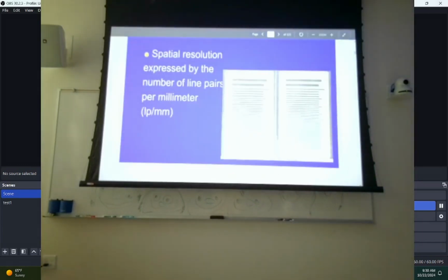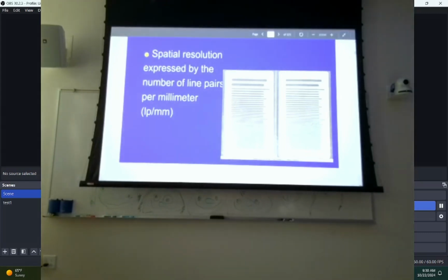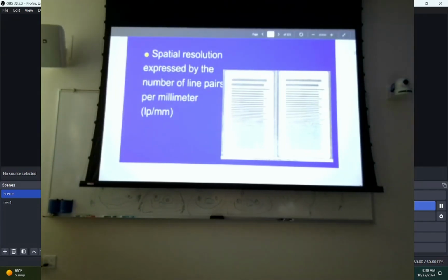This tests two things, essentially. One is your X-ray tube: is your focal spot giving you what your focal spot's supposed to be giving you? That's number one. Number two is your image receptor recording what it should be recording, right? So the things that can affect your actual focal spot size, one of those things will be the effectiveness of the focusing cup.